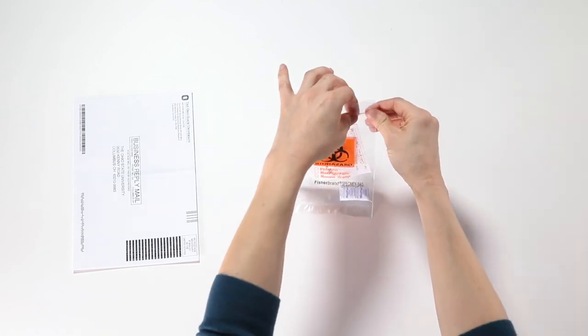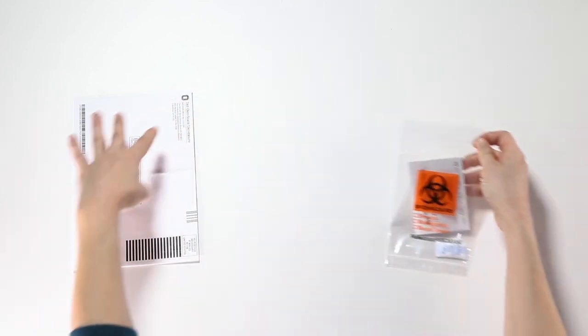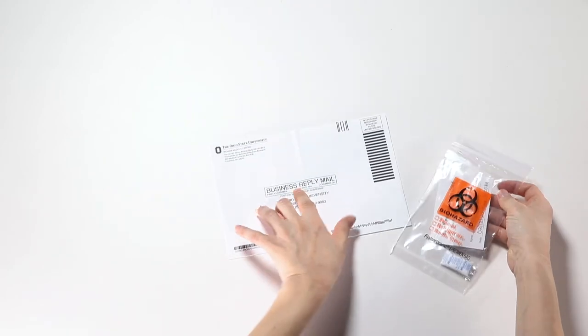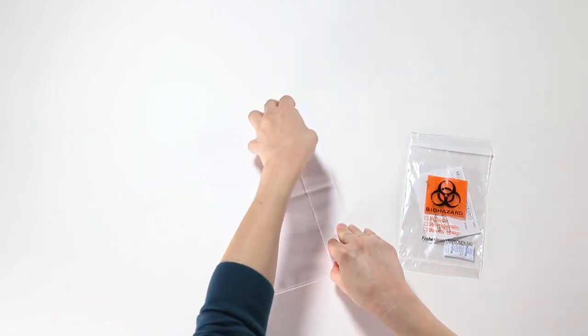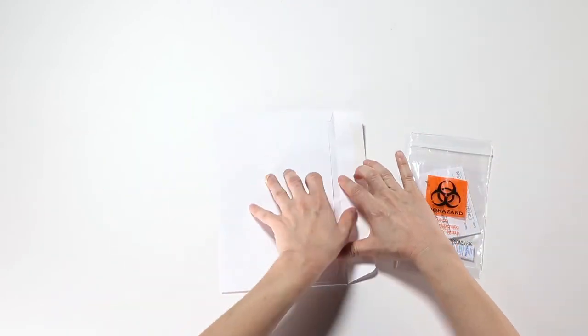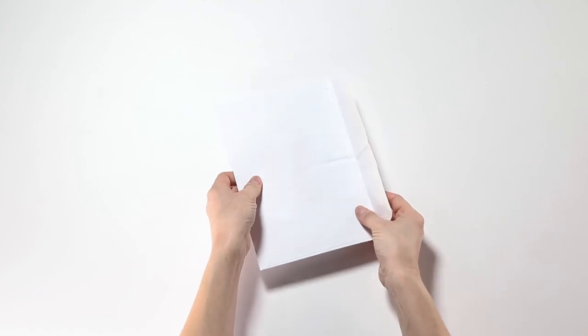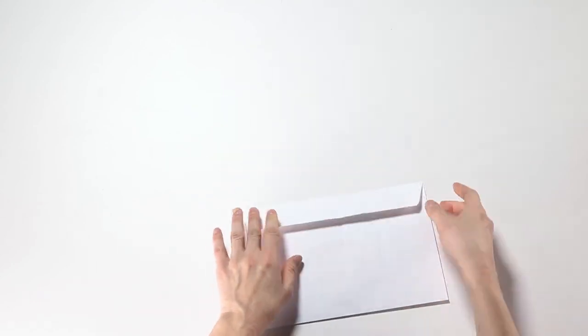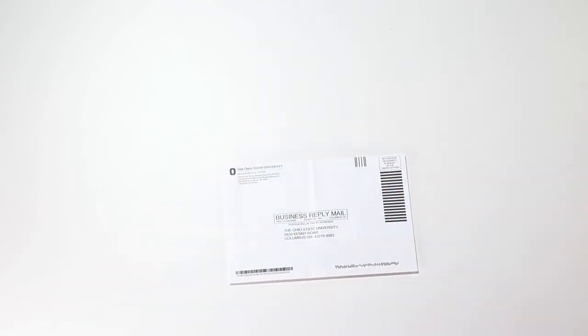Seal the plastic bag, being sure to remove any excess air. Place the plastic bag into the postage paid business return envelope. Seal the envelope and place it into the mail.